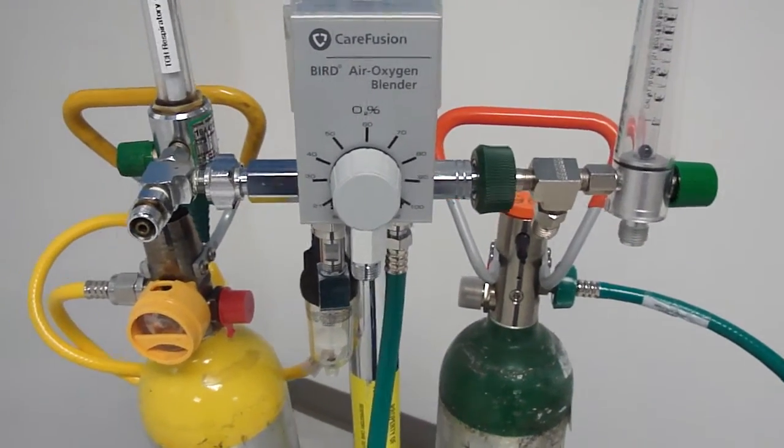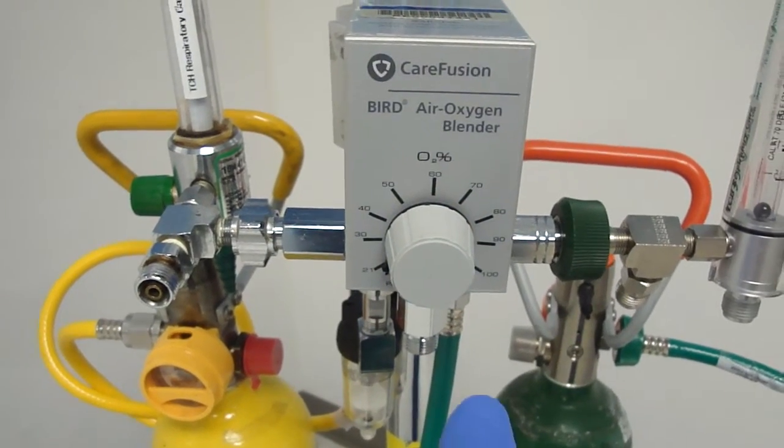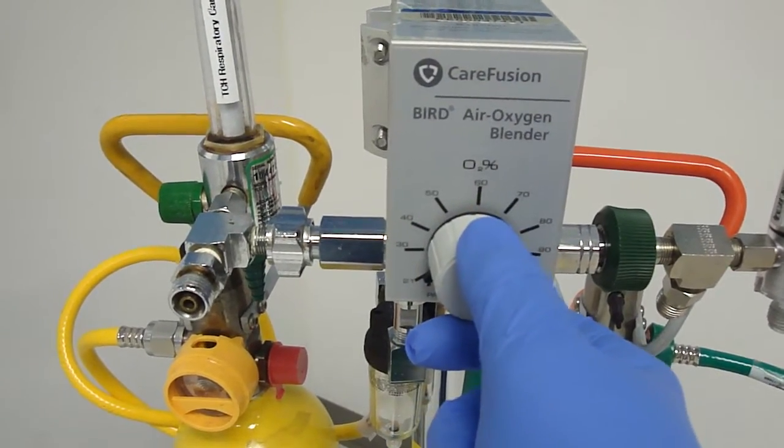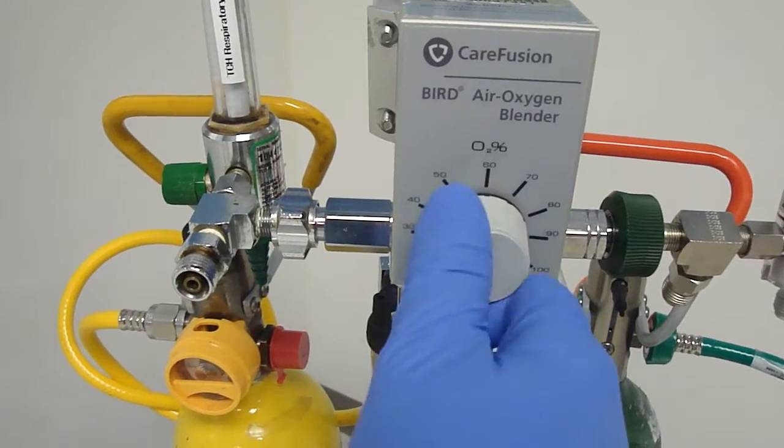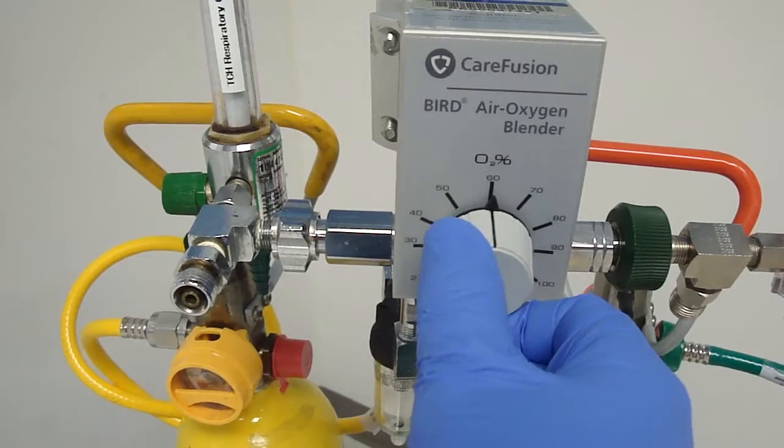Once the hoses are connected, you'll be able to titrate your FiO2 with your blender. 21% is all the way to the left, all the way to the right is 100%, and you can titrate anywhere in between.